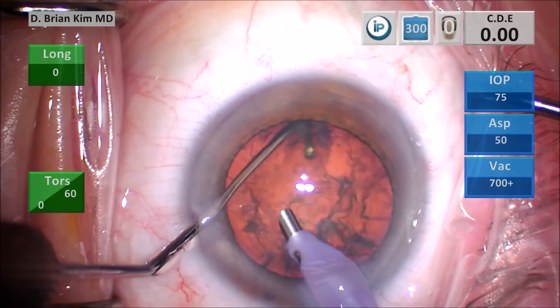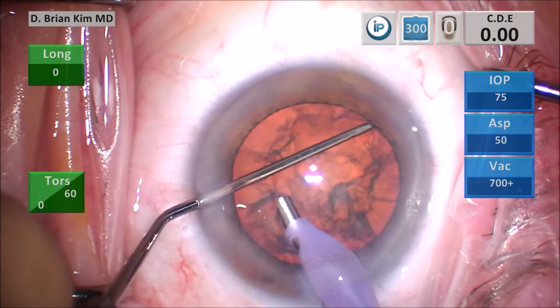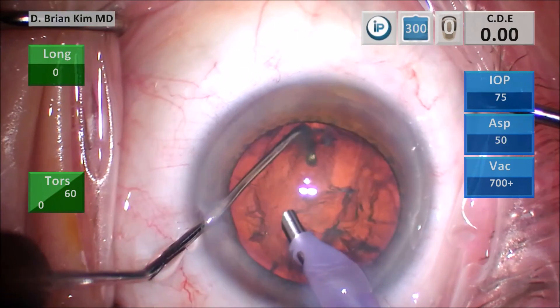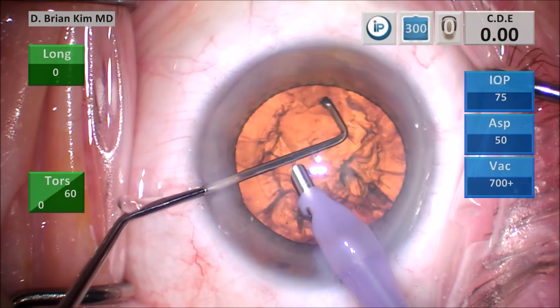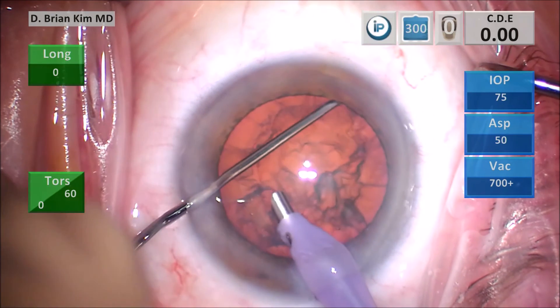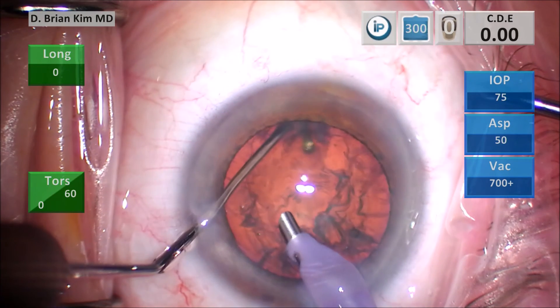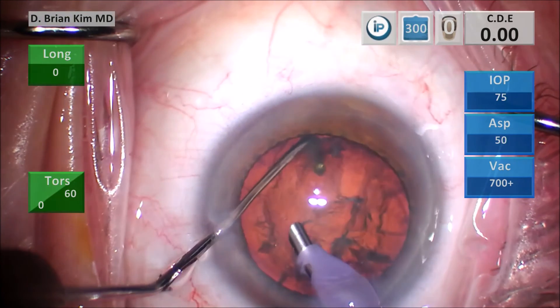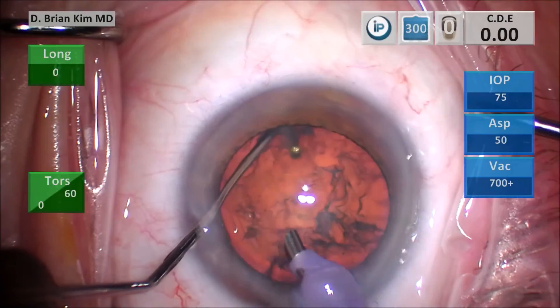To recap the two critical steps: you want to get the chopper out to the equator and over-supinate — the tip is actually tilted quite a bit. In slow motion, you're supinating your hand and rotating and tilting the chopper so that it's sitting more vertical. You can see the tip of the chopper and the actual flat edge of the chopper tip is more sideways. The reason you want it sideways is because it's holding and supporting the lens from below. I'm rotating, supinating, holding that chopper more vertical — the tip is in a more sideways position.